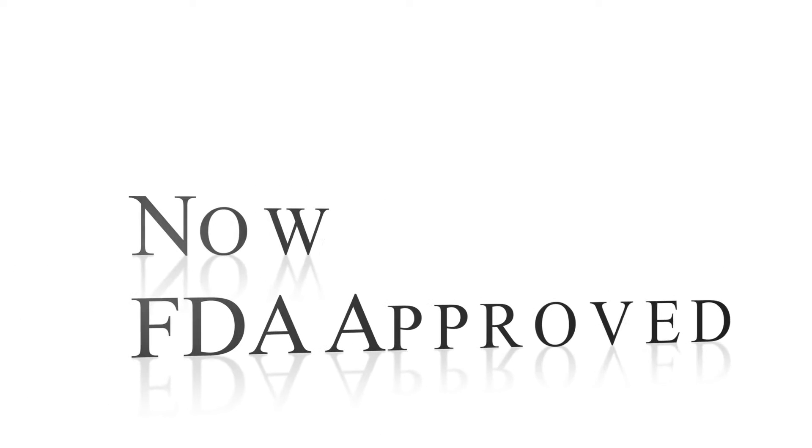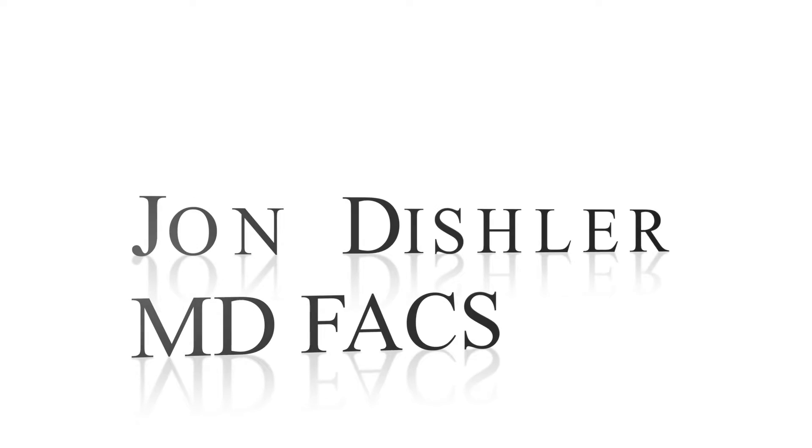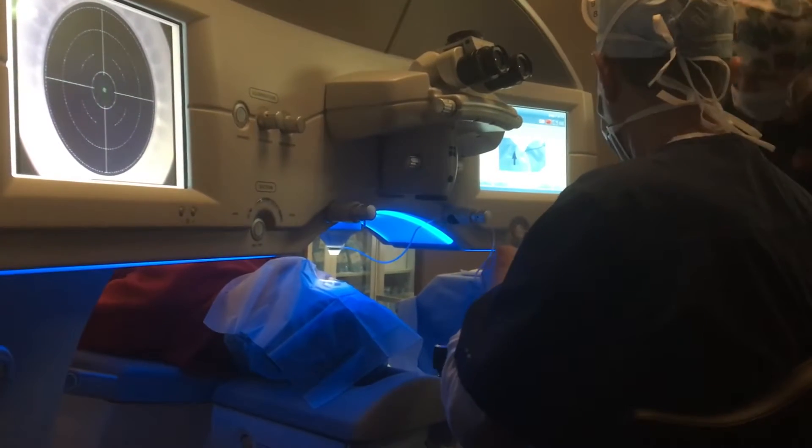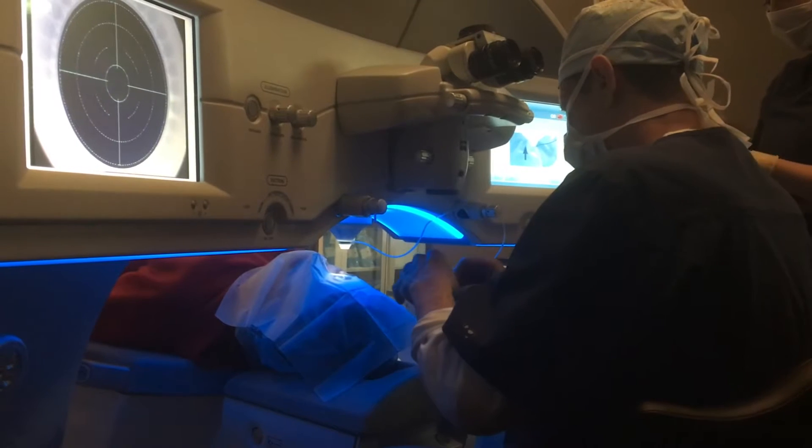I'm Dr. John Dishler and this is my first patient SMILE experience, the first patient done in the United States. It was done on March 3rd, 2017. Here the patient has been brought into the operating room, already prepped and draped, and the anesthetic drop has been placed.